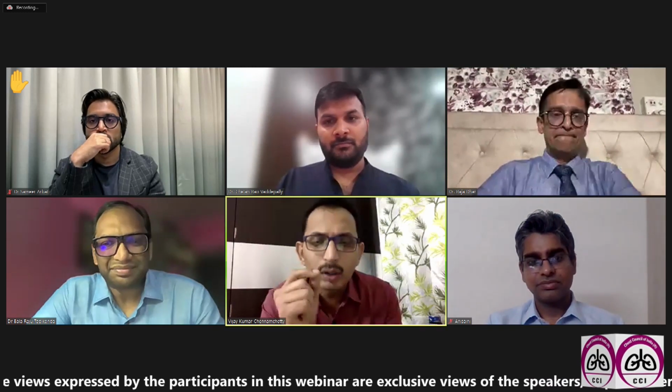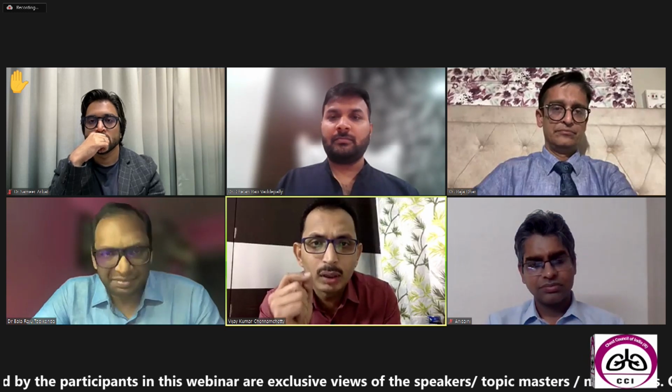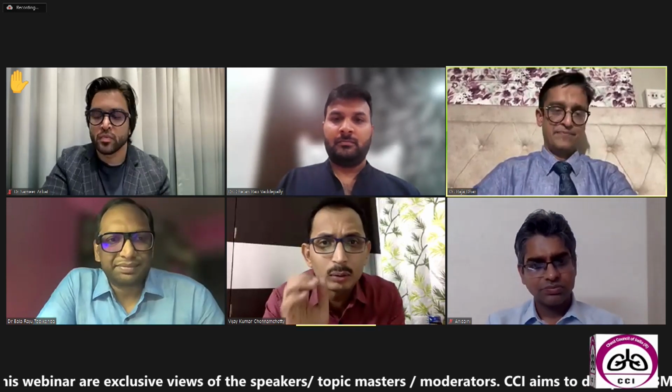Yeah, most importantly, without placing a proper balloon, without the balloon being in position, let's not do a cryolung biopsy. Sure. No, I think that's the point which I want to conclude. That's my closing remark. So that's your carry-home message for the audience, Vijay? Yes, sir. Okay, yes, wonderful.